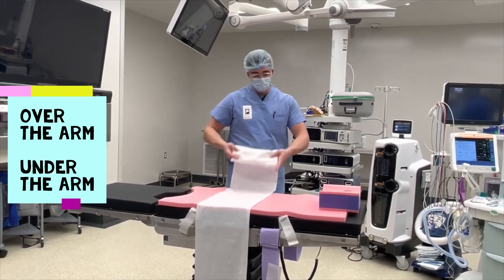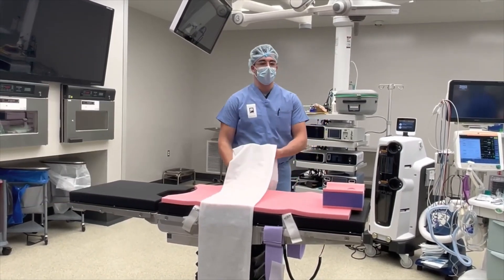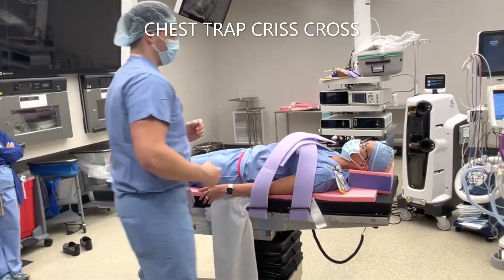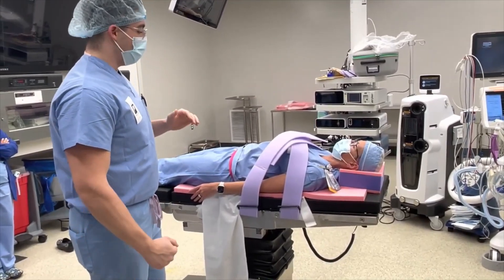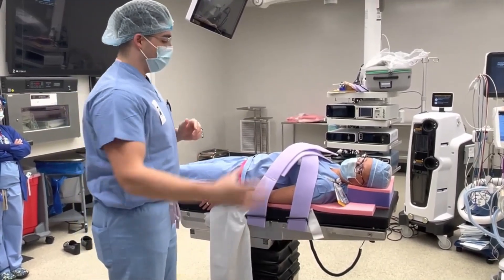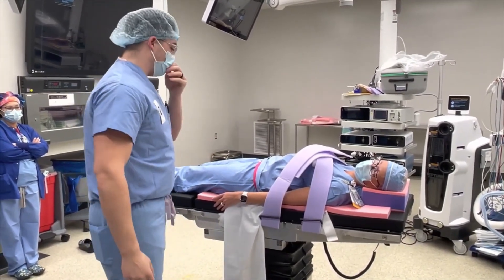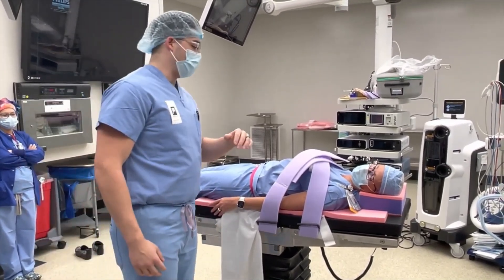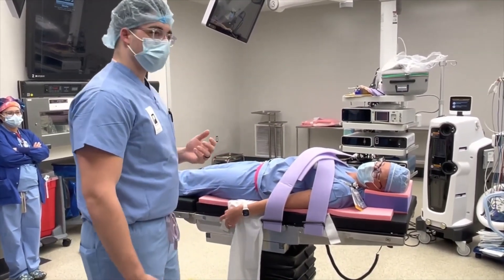You can go over and then under the patient, or you can go over the arm and under that way — whatever the facility preference is. It's not going to be like a shoulder bolster per se, but you use a little bit of imagination here. They're going to both be crossing over each other. When you go through, the face is big, so you can do one across the thighs, one across the ankles, and then two across the chest and pull it out — that will work too.